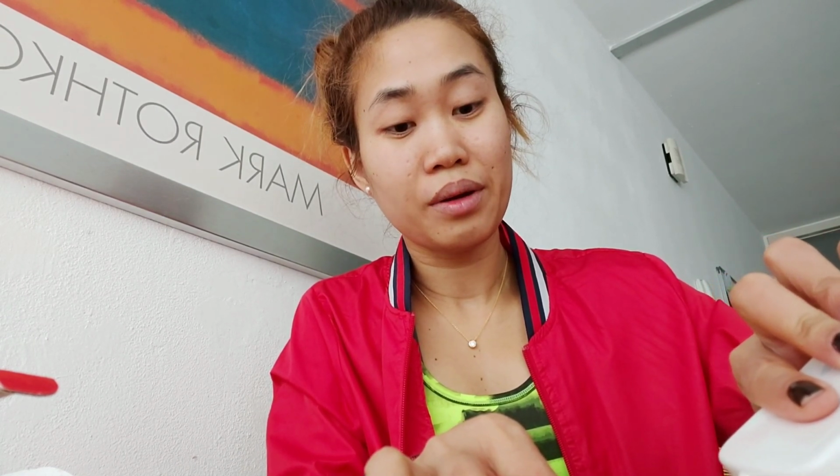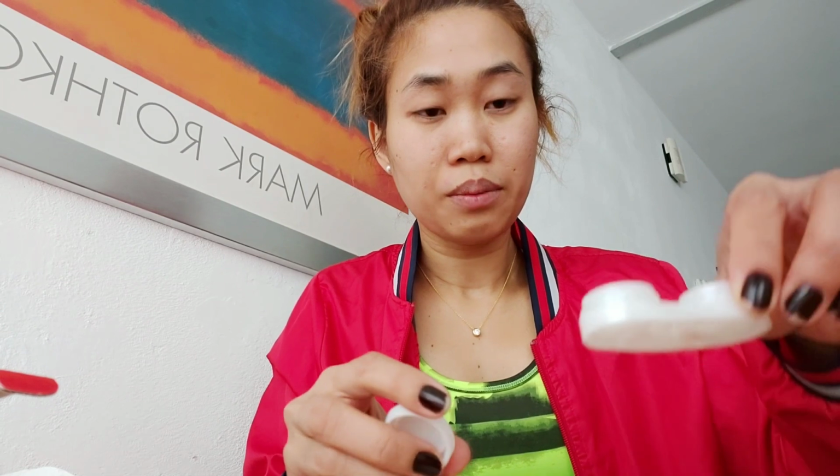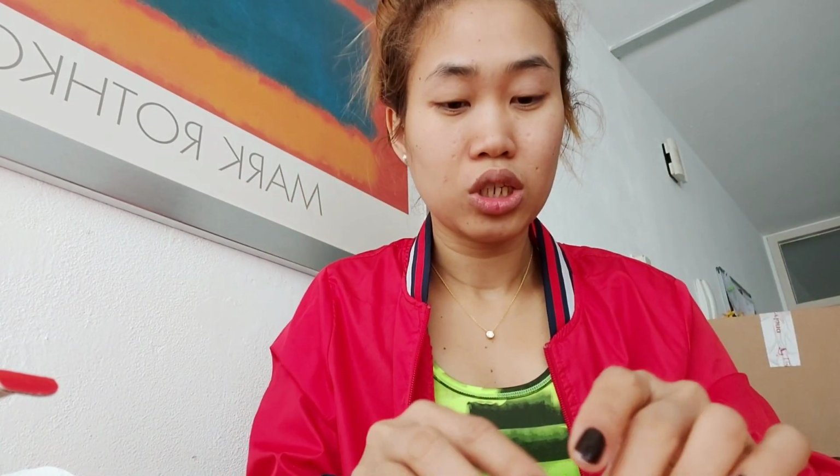In my first time, guys, oh my goodness, I think I spent more than an hour because when it comes to the eyes, it's really scary, it's really sensitive. And by the way, I'm putting solution in my case so that I can bring this to my practice, and if ever something happens or I feel itchy, I can just take it off, and I have it with me. So make sure that you always bring your case for your contact lenses, and make sure you have enough solution.